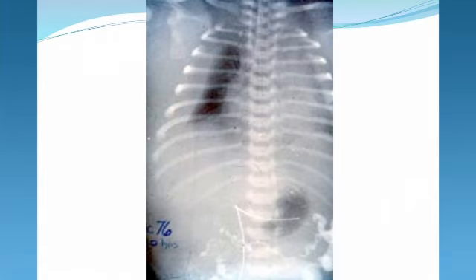And here's a baby with severe hydrops and significant fluid, bilateral pleural effusions, and that baby will have a small lung that needs to be managed gently.